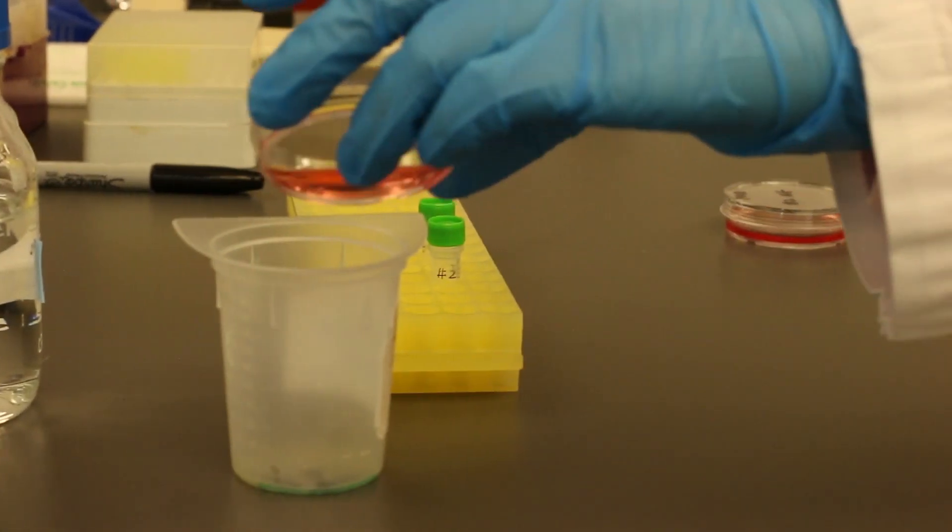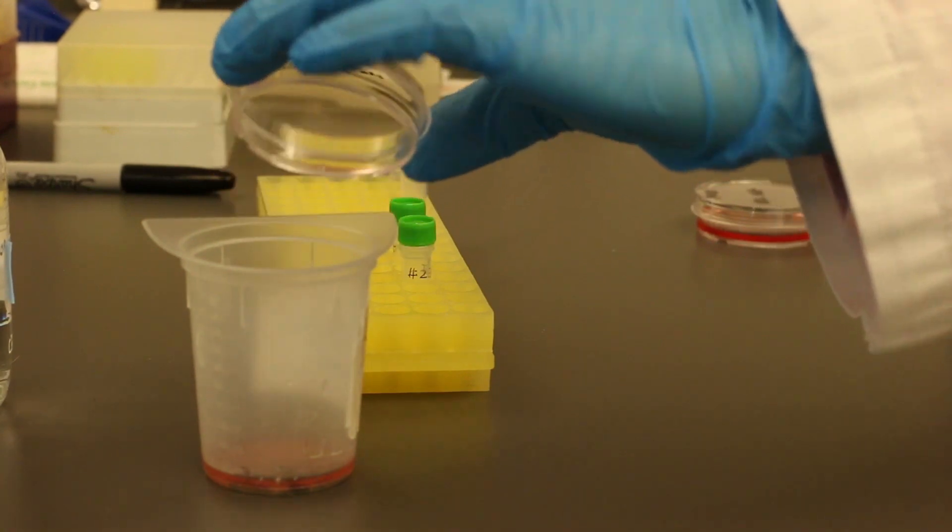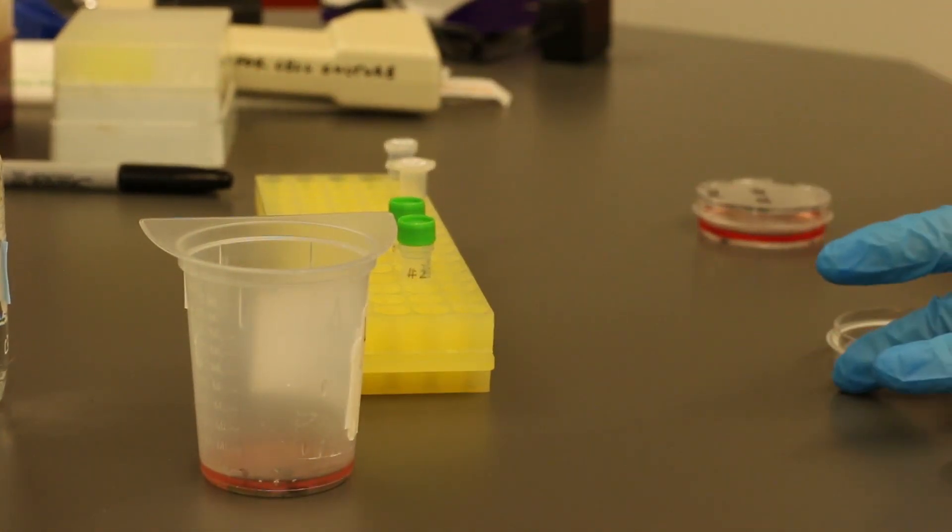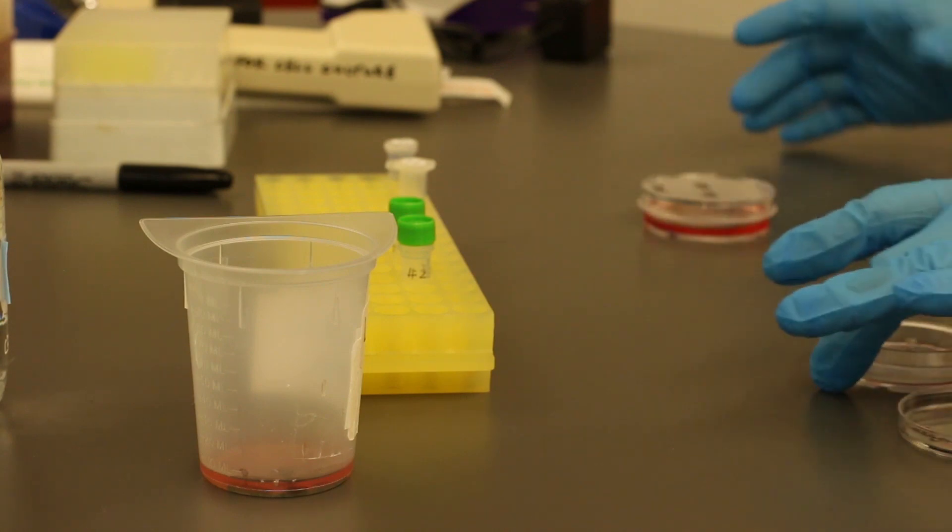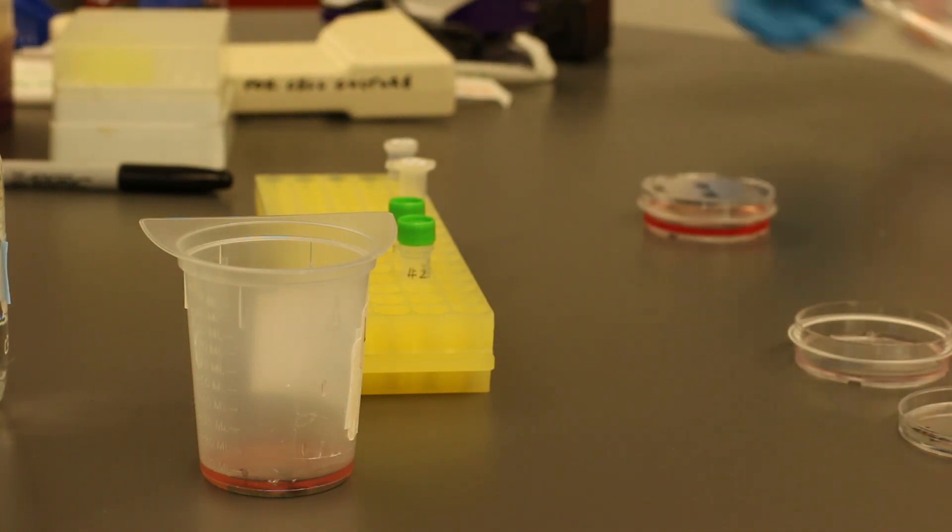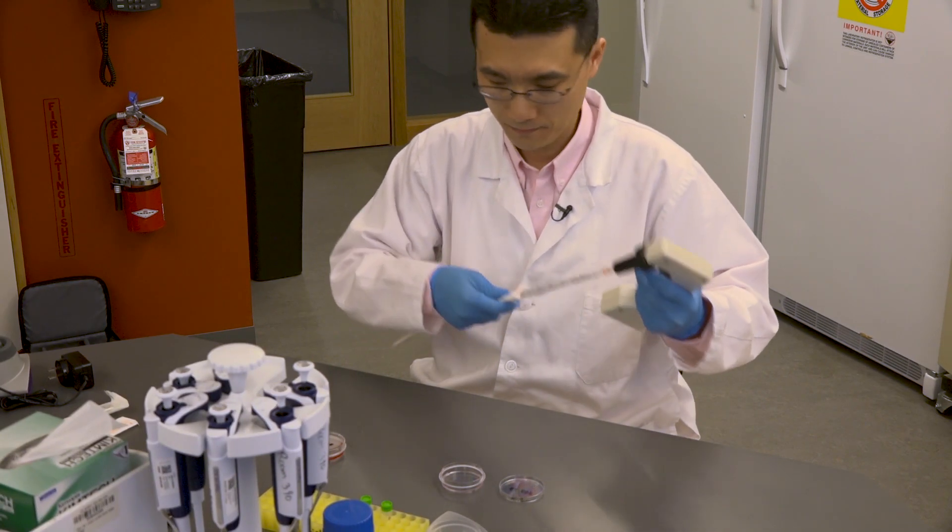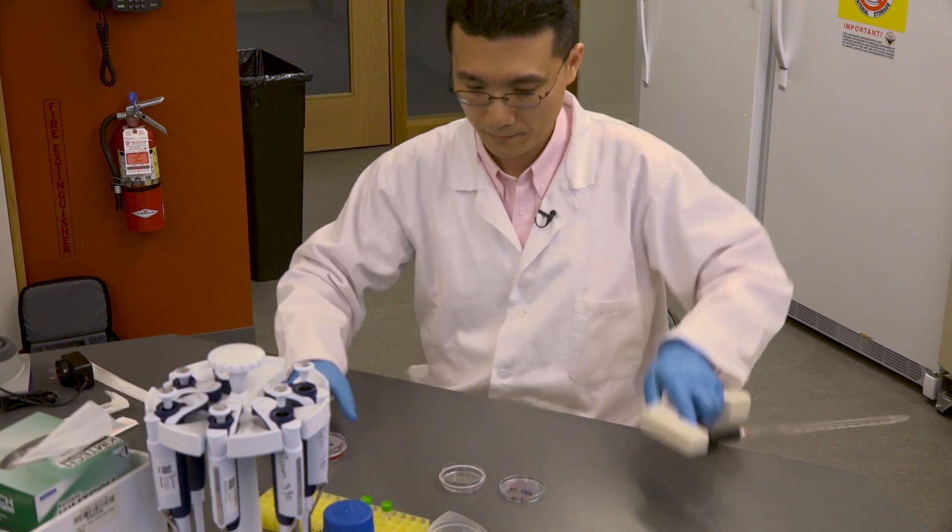Gently pour off the medium into the liquid waste container on your bench. You should notice the cells remain attached to the bottom of the dish. Then wash the cells in each dish with 5 milliliters of TBS to remove the remaining media proteins that potentially affect your Western blot results.